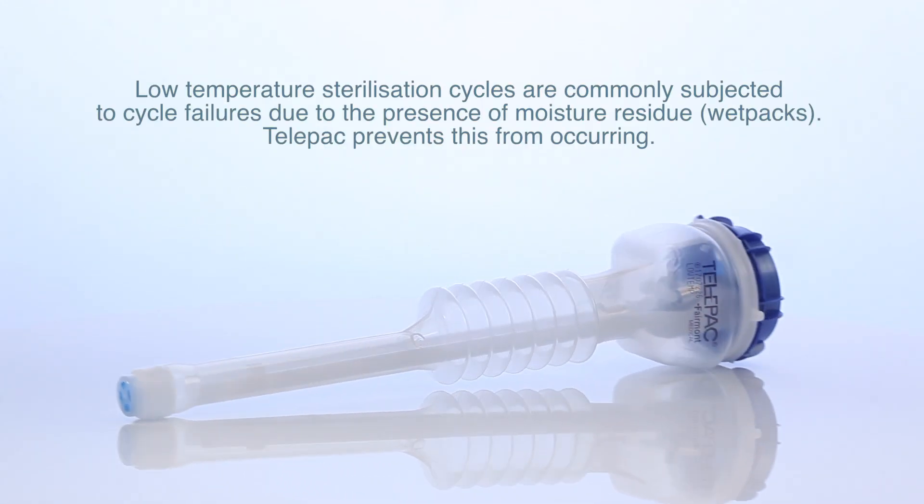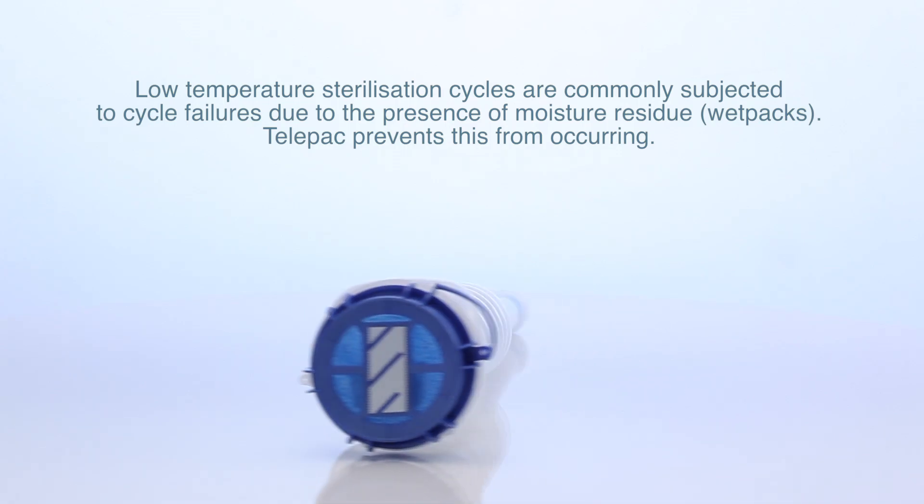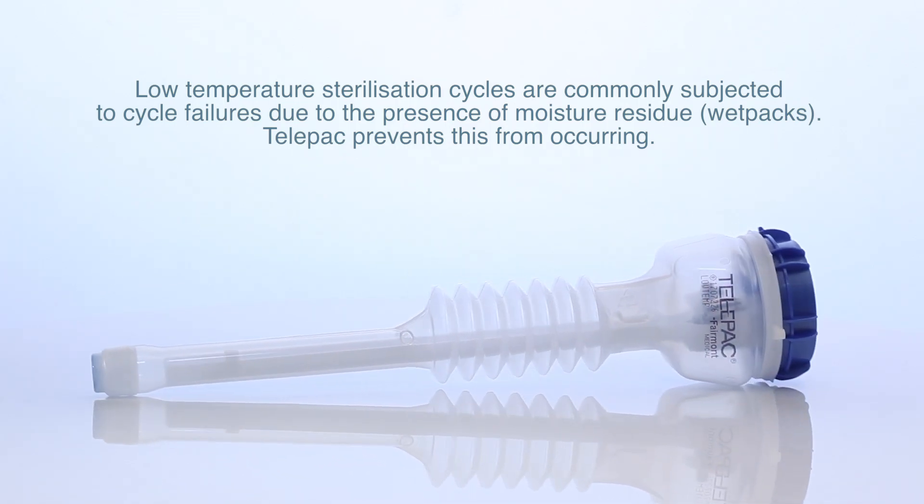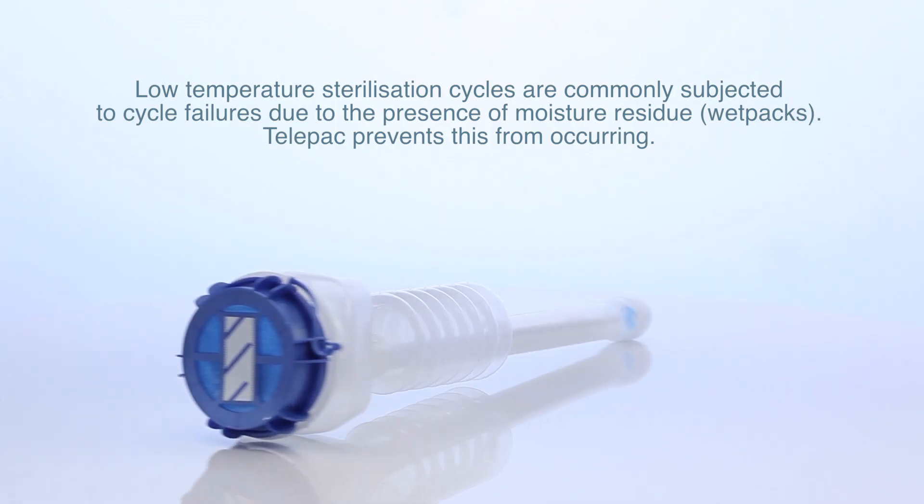Low-temperature sterilisation cycles are commonly subjected to cycle failures due to the presence of moisture residue. Telepack prevents this from occurring.